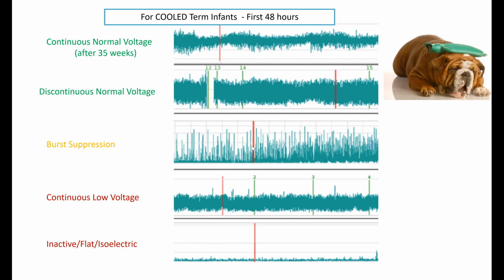So you didn't see any activity, you mean? No. Yeah, so remember that aEEG is just a compressed trend of EEG over just certain select areas. So for true diagnostic purposes, for calling end of life situations, we still rely on our full EEG. And I would just defer to the neurology definitions around that. Certainly medications do make an impact on that.